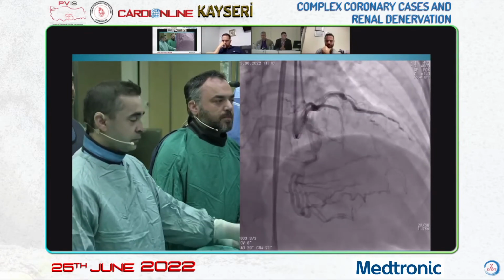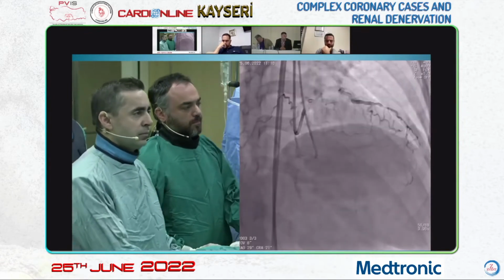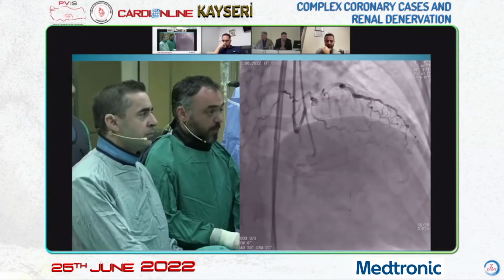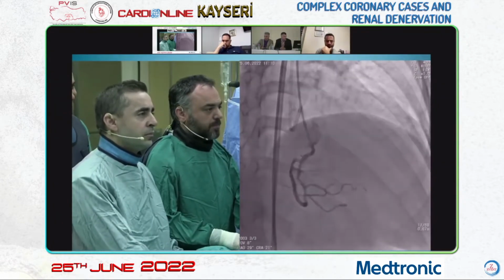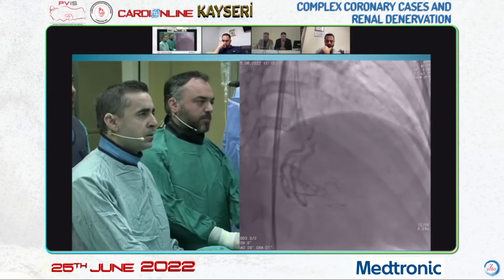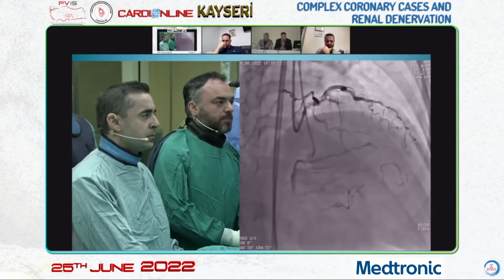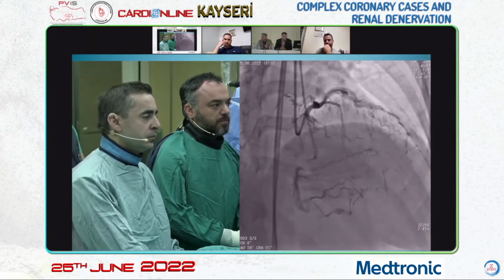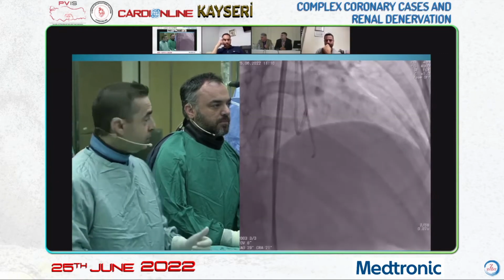Of course, it was tried earlier. It seems to be blunt-ended. The length is longer than 20 millimeters. We cannot see the vessel clearly. For the scoring, it seems to be a difficult case. First, I would like to give the floor to the panelists.